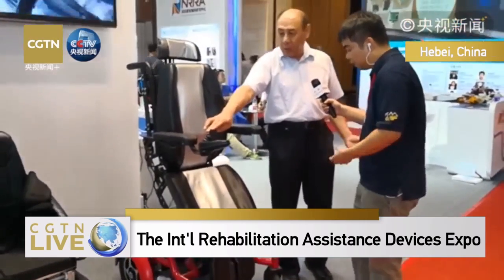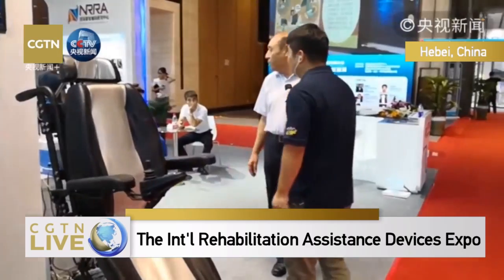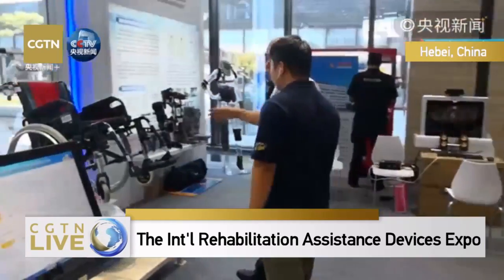So these are the 3 basic human postures. You can adjust these mobility assistant devices to a posture that is most suitable to you.